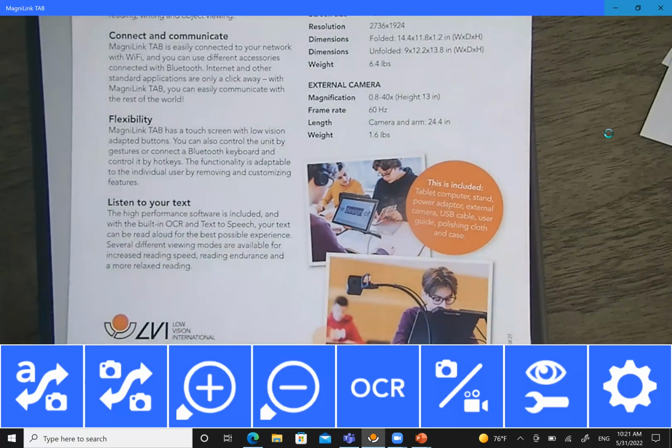So you have the ability to make it go straight up. You have the ability to bend it over. The cool thing about that is you can actually use this distance camera around the front of the system, behind it, or off to the side. So there's so many options for using this.